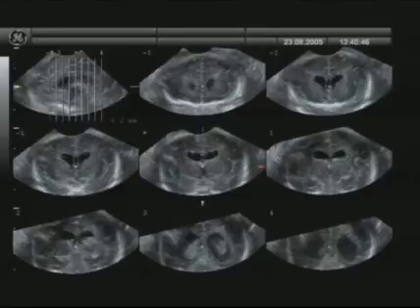And here I've taken one volume. And in this volume, I'm displaying these cuts going from the front of the head to the back. And the display goes from the front all the way through the cavum septum, all the way through to the back, to the choroids, and back here to the occipital horns.